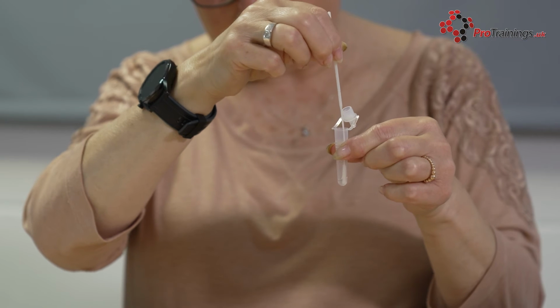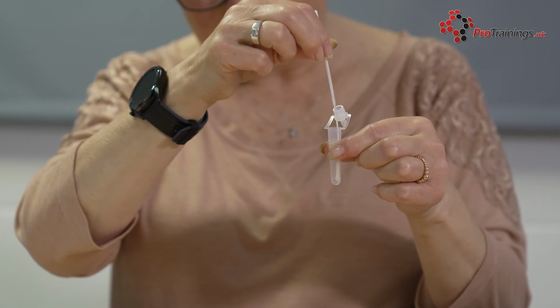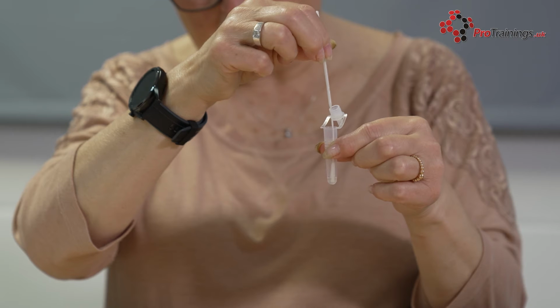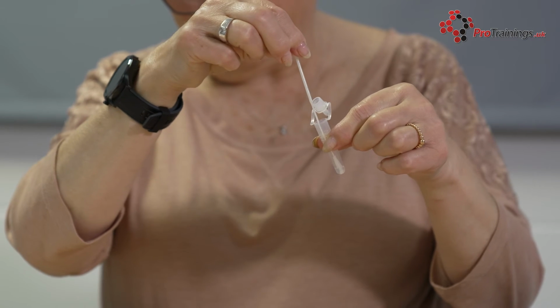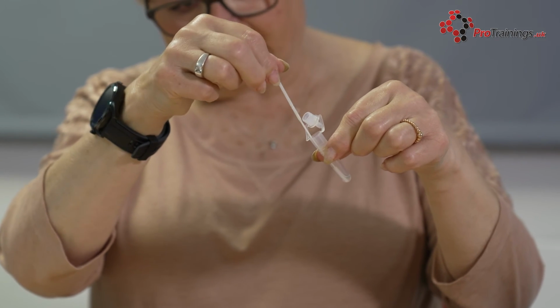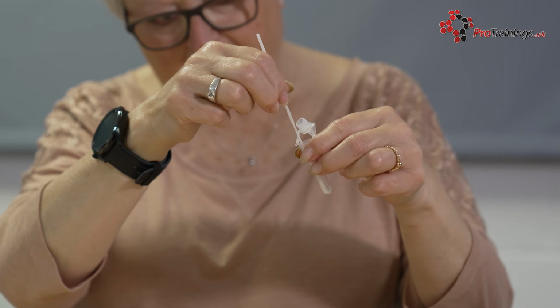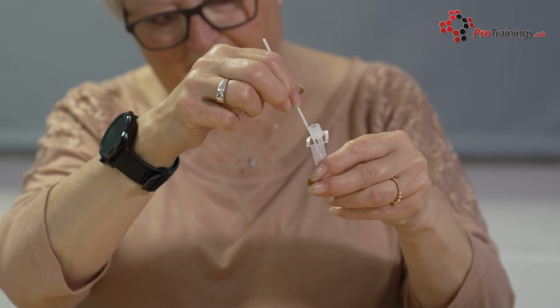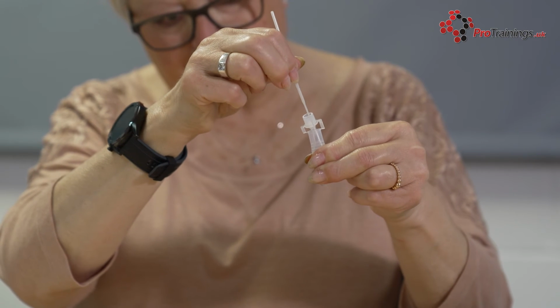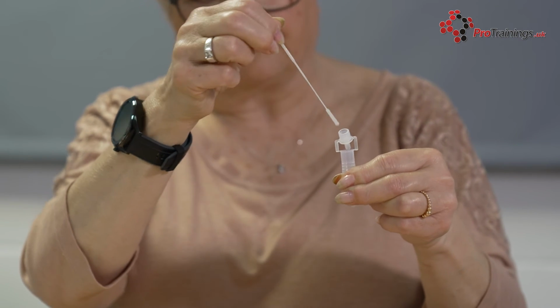To process the sample, pick up the extraction tube and place the fabric tip of the swab into the extraction tube so it's in the liquid. Press the tip against the edge of the extraction tube with force while rotating it around the extraction tube for 15 seconds. This allows the sample to be transferred into the liquid. Pinch the extraction tube against the swab as you remove it. Make sure you remove all the liquid from the soft tip of the swab.